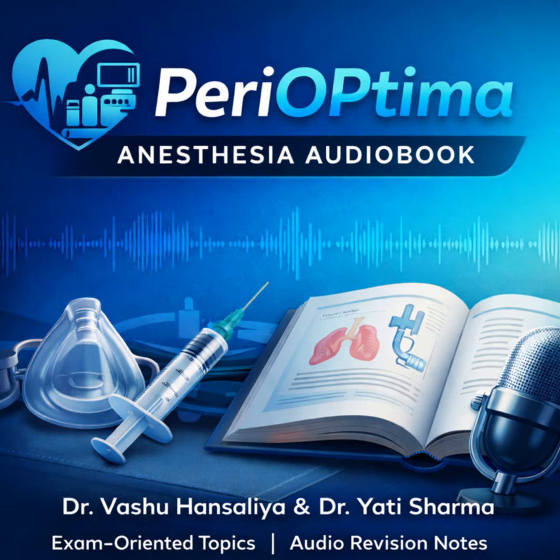And the innovation is brilliant. It's twofold. First, as you said, less force overall. Second, and this is the crucial safety feature, flexing the tip actually moves the fulcrum point deeper into the pharynx, away from the teeth. Away from the upper incisors. This massively reduces the risk of accidentally levering on and damaging the patient's teeth. It's a game changer in a difficult intubation.